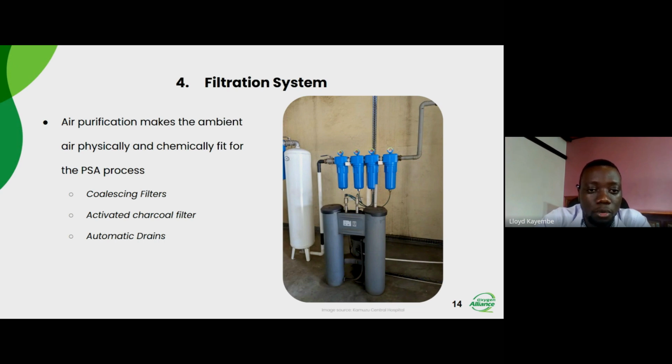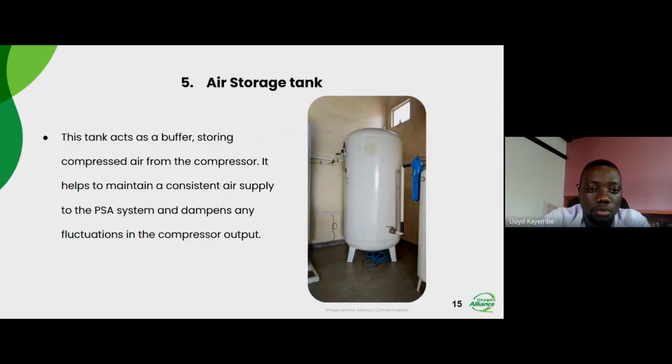Yeah, so the next component is an air storage tank. This simply acts as a storage for the compressed air. This helps maintain a consistent air supply that dampens any fluctuations in the compressor output.